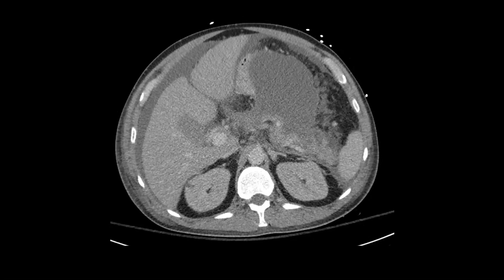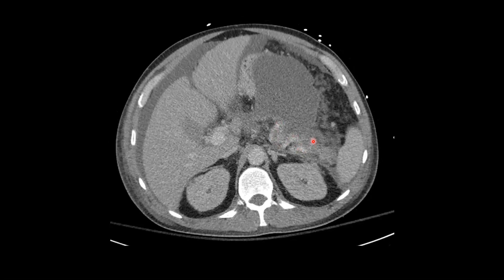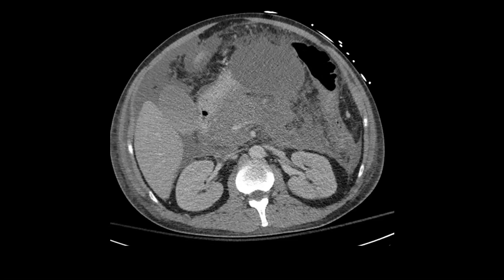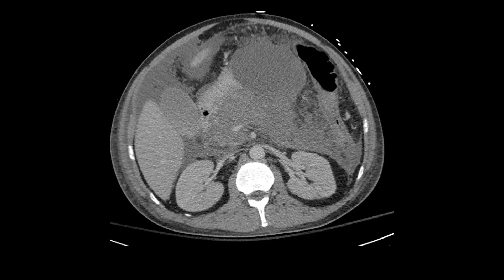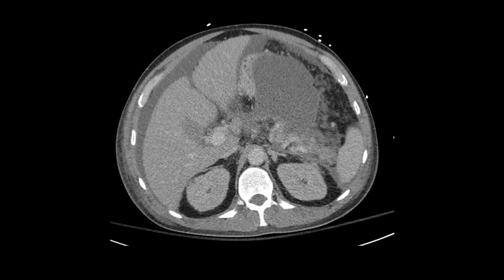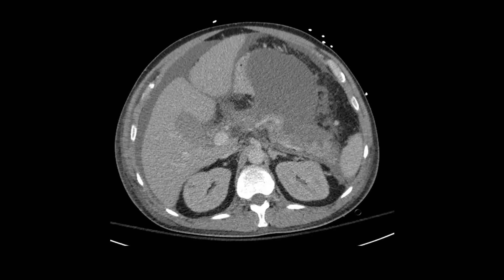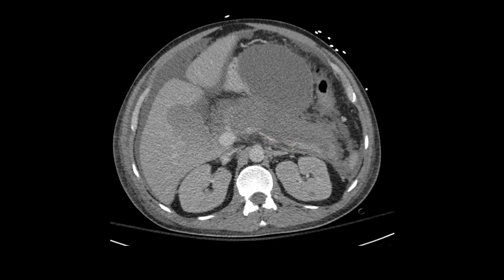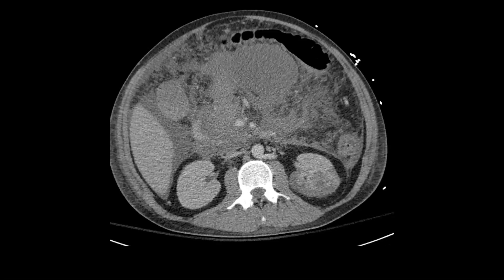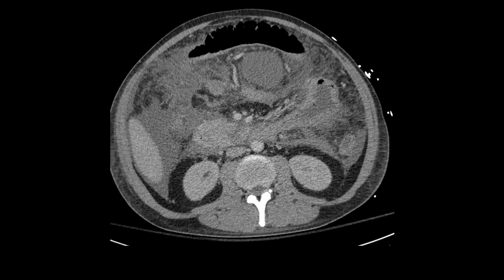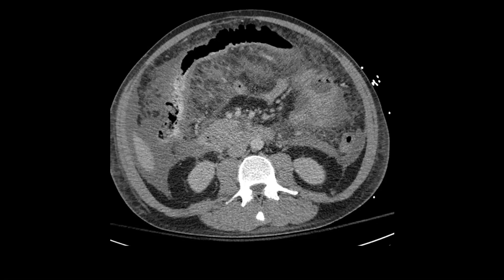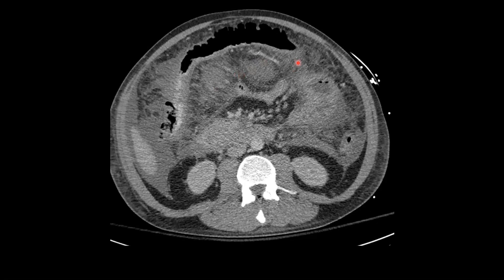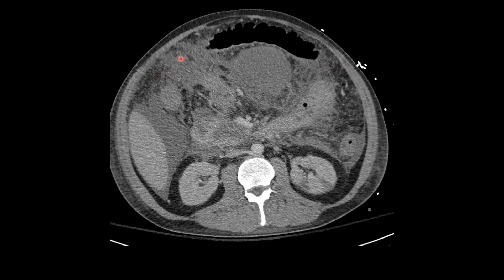Looking at the pancreatic vascular structures, we can see the splenic artery in the pancreatic tail and the gastroduodenal artery in the pancreatic head — no evidence of pseudoaneurysm formation, which is something we want to look for. The splenic vein looks increasingly diminutive but remains patent. As we scroll inferiorly, the peripancreatic stranding has profoundly increased. Now we don't only have pancreatic necrosis, but peripancreatic necrosis extending throughout the mesentery and out into the omentum.